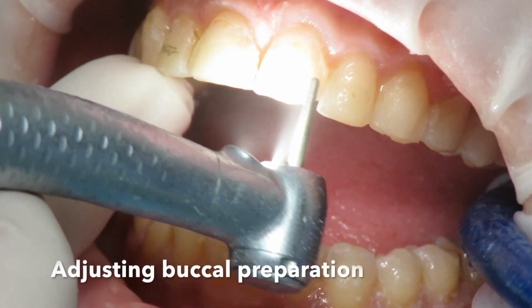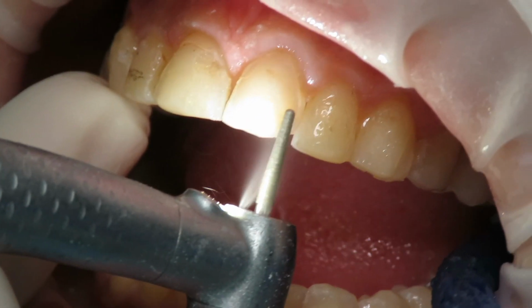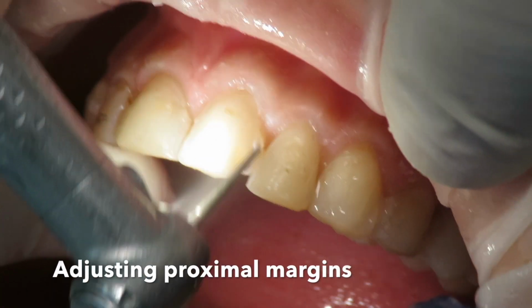So finalizing the prep, doing a well-designed chamfer, of course, with some good marginal level.